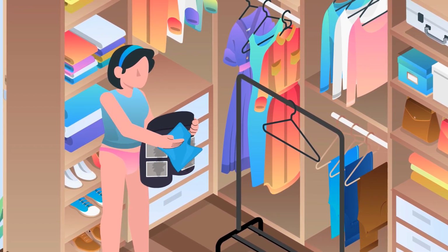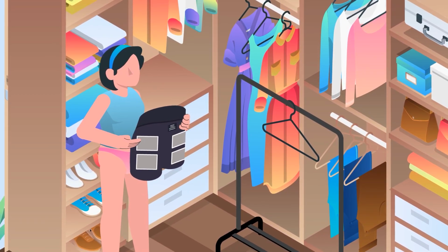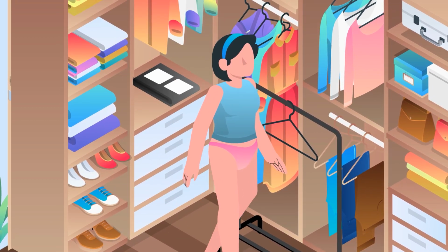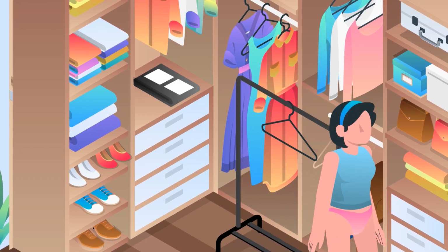You'll notice the shorts will be inside out when they are removed. While the shorts are inside out, fold the shorts as such, ensuring the electrodes remain flat. Store the product for your next treatment session.